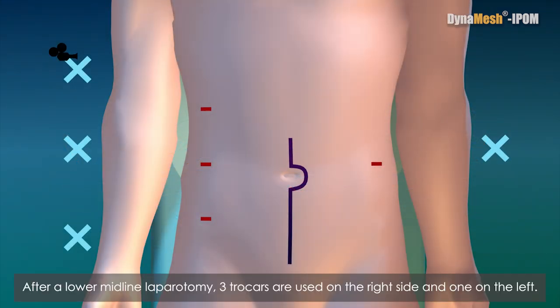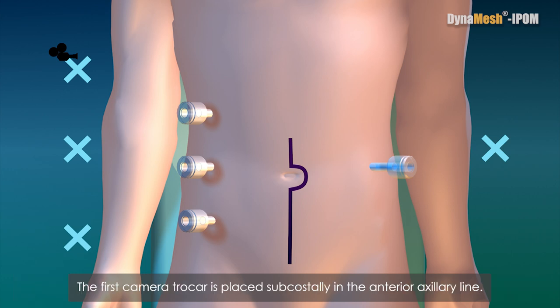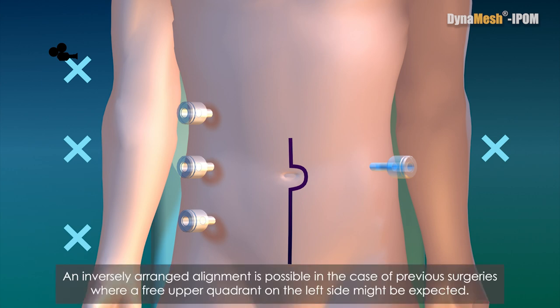After a lower midline laparotomy, three trocars are used on the right side and one on the left. The first camera trocar is placed subcostally in the anterior axillary line. An inversely arranged alignment is possible in the case of previous surgeries where a free upper quadrant on the left side might be expected.